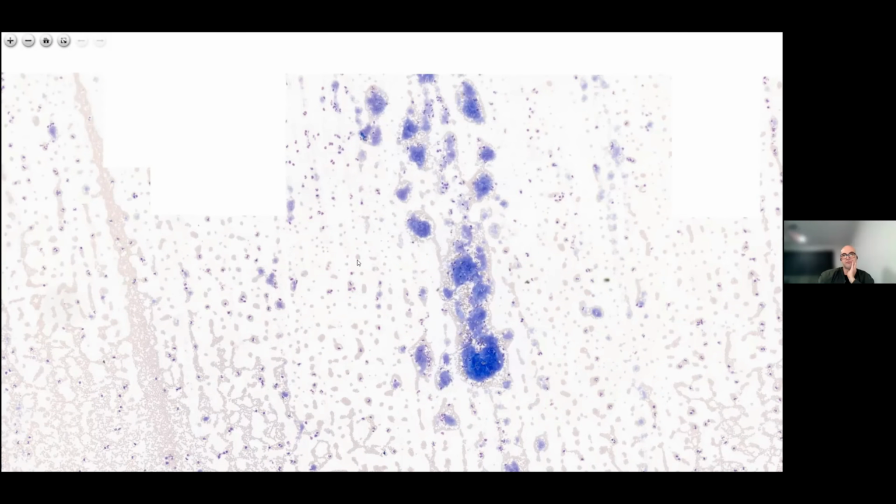I have been in some scenarios where you can get platelet clumping even in alternative anticoagulants, and they're really challenging. There's a question about what happens if you get clumping in a citrate or heparin. There's no clear answer, because even platelet counts by flow cytometry will still be clumped, because you're still using the same thing.